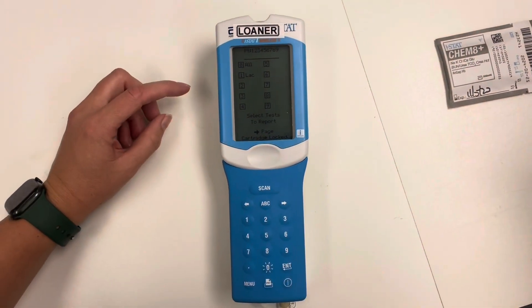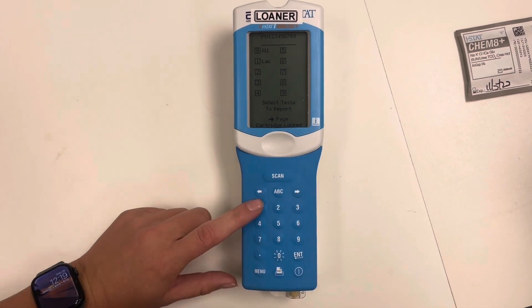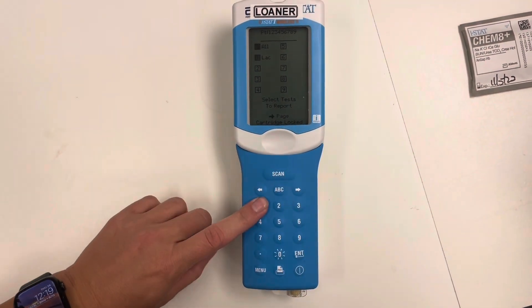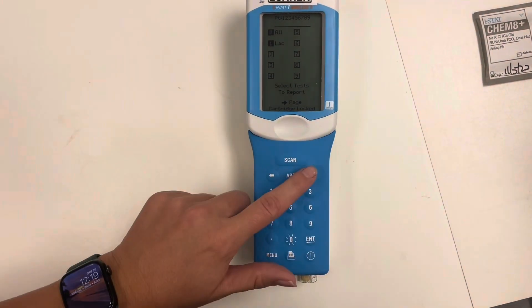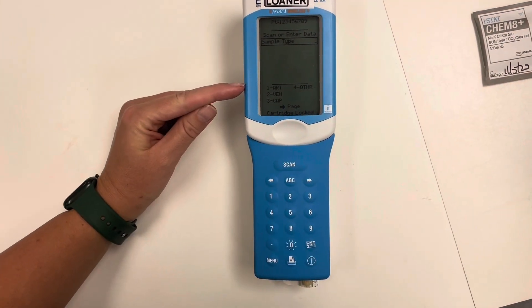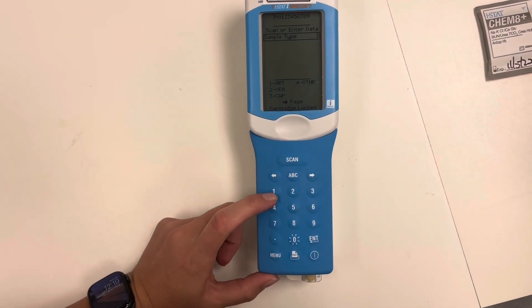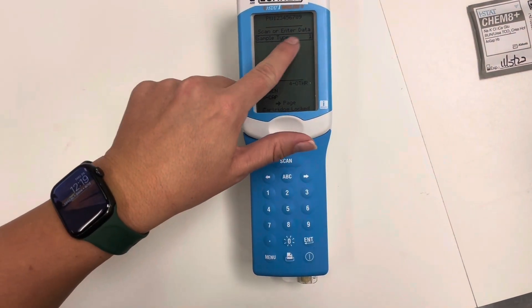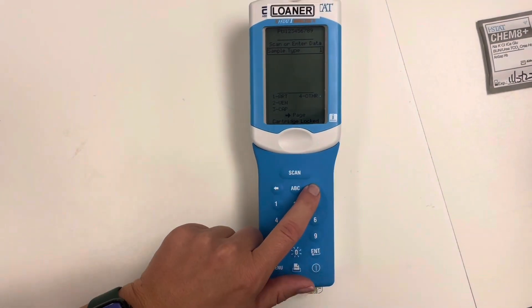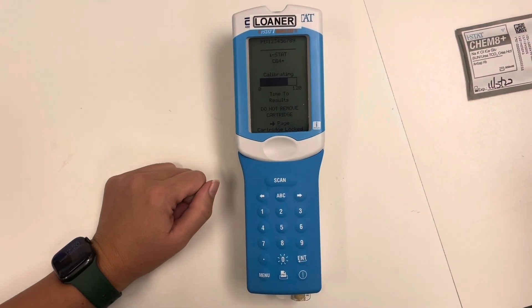As this is our lactate one, we could either press zero and it's going to select all, or we can hit one and it's just going to select the lactate. We are then going to hit the arrow key. We're going to hit either ICU arterial or venous — we are going to put arterial. You can see sample type one.